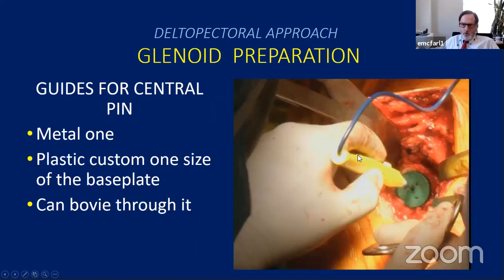The next thing you want to do is figure out where to put the glenoid component. We had a little custom plastic piece like this made. You can use the guides that are provided by the company. Where you put this is a little controversial. It used to be thought that you should put the sphere as far down on the glenoid as possible. I don't know that that's necessary so much. You want it close. Kind of depends on the system you use.